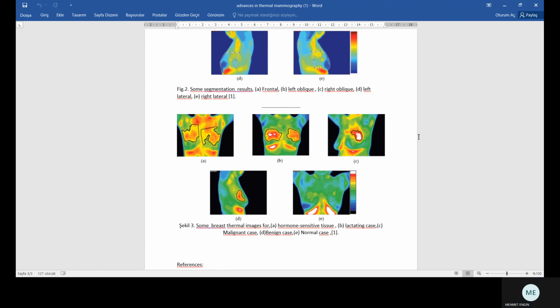Last aspect, automated classification. Computer algorithms based on artificial intelligence and machine learning are making huge inroads in automated diagnostics. Many methods of supervised classification are being developed where a small group of patient data is used to train a probabilistic model that represents the decision criteria based on the extracted features.